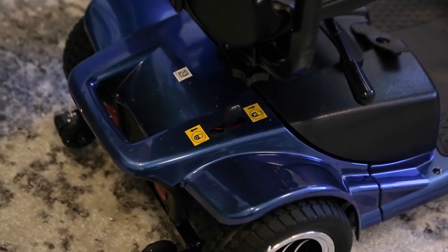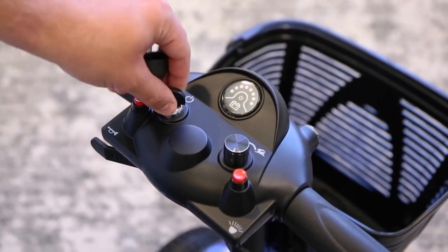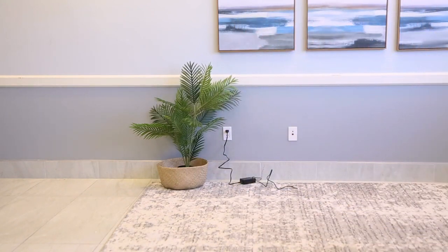You're almost done. Once it's charged, check the lever in the back to make sure it's switched to D for drive. Take the key and turn your scooter on. Now you have the freedom to go anywhere and everywhere with your new Vive scooter. We wish you safe and happy travels.